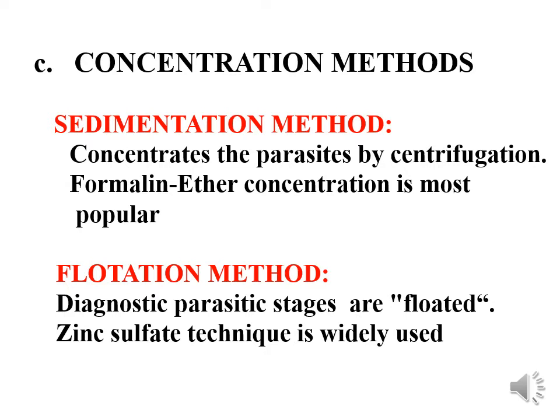You keep it without disturbance for 10-15 minutes, so anything which is light will float and attach to the cover slip. Gently remove the cover slip, put it on a slide, and you examine. Both sedimentation and flotation concentrate the parasites and enhance the possibility of detecting mild infections. Of course, each one of these methods has pros and cons, advantages and disadvantages.